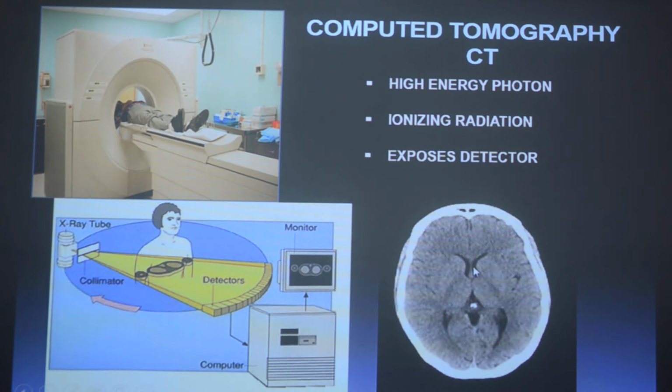Ventricles. The ventricles, good. So these are CSF containing ventricles which are black. This is the gray tissue which has white matter and the gray matter. And this white is the bone, which is the skull bone. So you see black, gray and white. So different shades of gray.